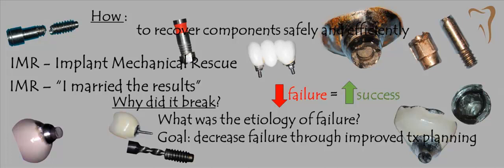So the first question we had was, how do you recover components safely and efficiently? And we spent a lot of time working with the instrumentation and doing that. So when you do one effectively and efficiently, it's successful. And we can call that IMR.